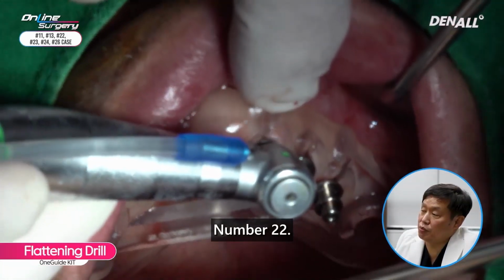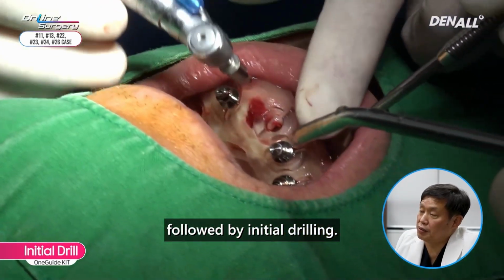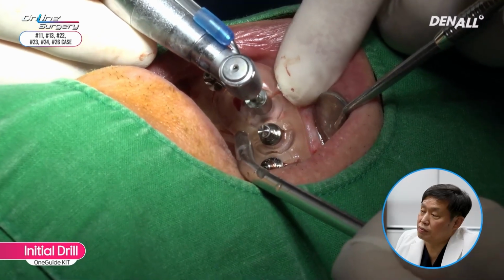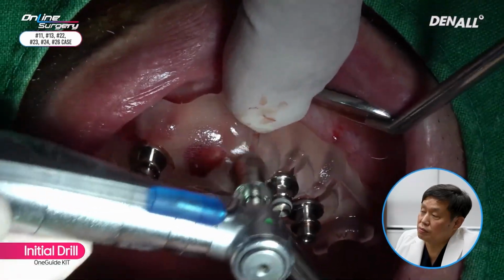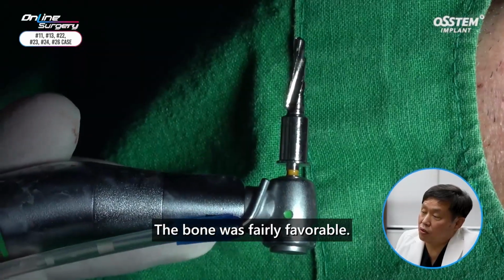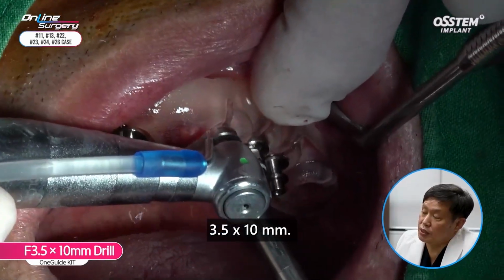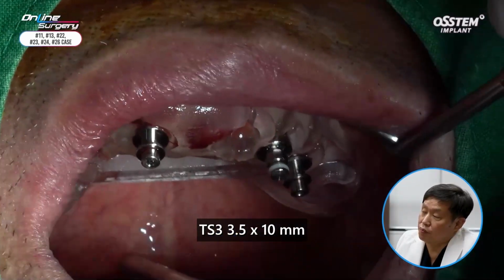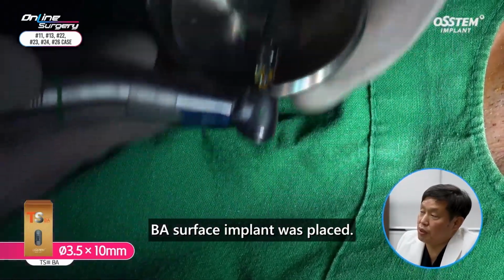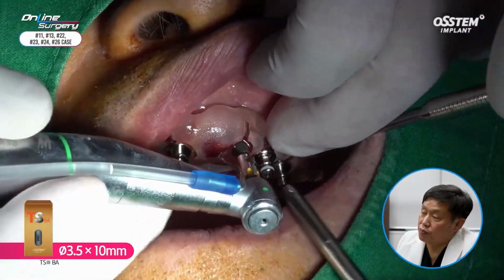Number 22. As was done earlier, flattening drill was used, followed by initial drilling. Initial drilling was done. The bone was fairly favorable. 3.5 by 10 mm OneGuide drill was used. A TS3 3.5 by 10 millimeter BA surface implant was placed. In number 22, the diameter was 3.5.